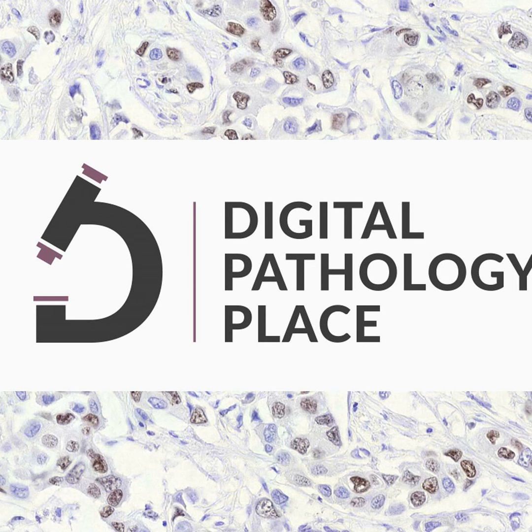Through the detailed analysis of digital pathology slides, researchers can uncover specific disease markers or patterns that correlate with a patient's response to a particular drug. This information can then be used to develop diagnostic tests that identify these markers or patterns in future patients, effectively predicting their response to the drug. Moreover, the integration of artificial intelligence and machine learning in digital pathology can automate and enhance this process. For example, AI algorithms can be trained to identify subtle histological features that might be overlooked by human observers, thereby improving the accuracy of the companion diagnostic.